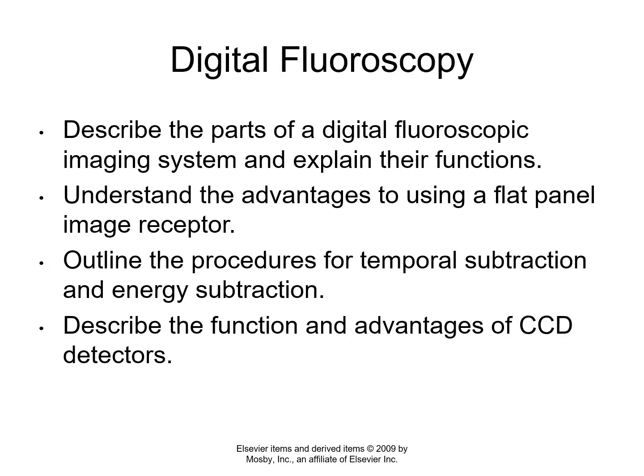All right, so digital fluoroscopy is obviously different than conventional fluoroscopy. The first iteration of digital fluoroscopy was to replace the television camera and the film cameras that we had stacked on top of the image intensifier with the first iteration of the digital camera, which is the CCD. But since then we've evolved and replaced that with a flat panel detector. So it's like first and second generation digital fluoroscopy, but we're doing different things because we are digitizing the image. And that gives us powerful tools, the ability to manipulate the image data via software. And so those are clearly advantages.